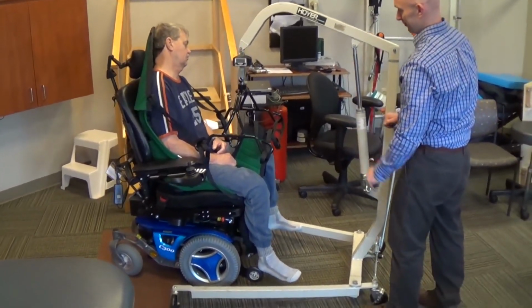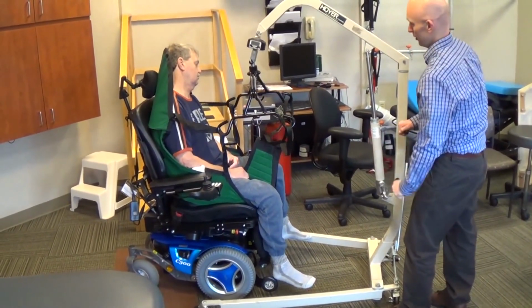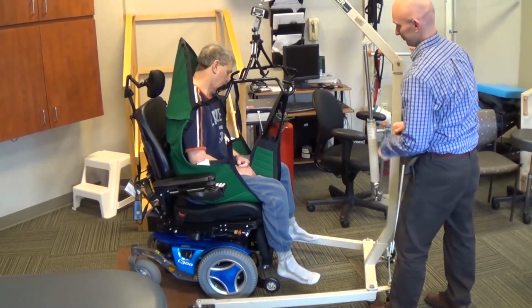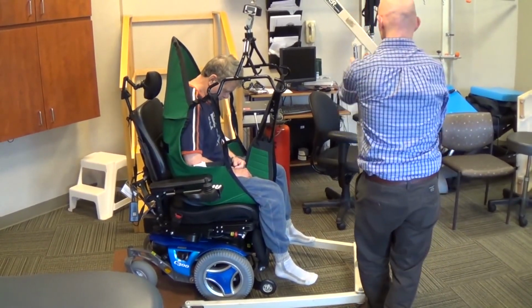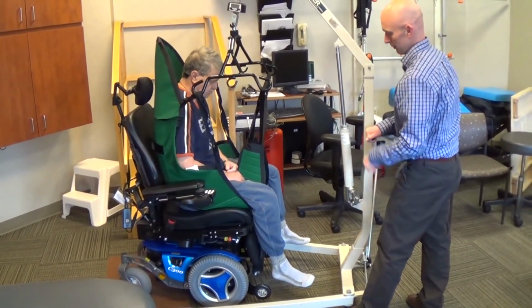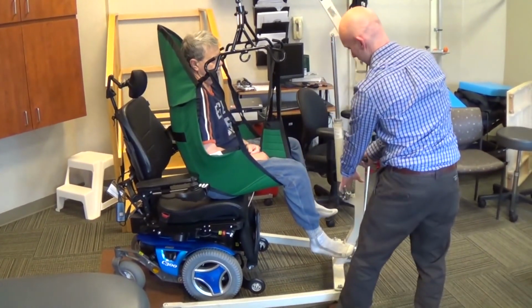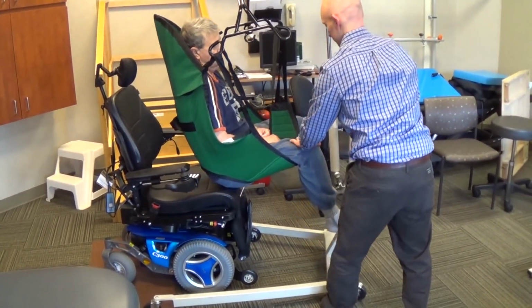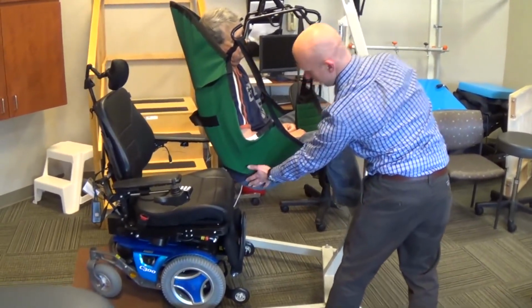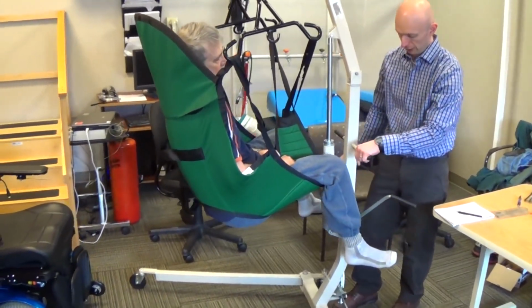Next, I'll just secure the brake. And I'm just watching to make sure none of the straps are hooked on the wheelchair armrest. If you can bring your head back a little bit. And just being mindful too that the person's legs do not hit the bar. We're clear out of the chair. I'm going to pull the lift back. It's easier to maneuver the chair with the base narrower.